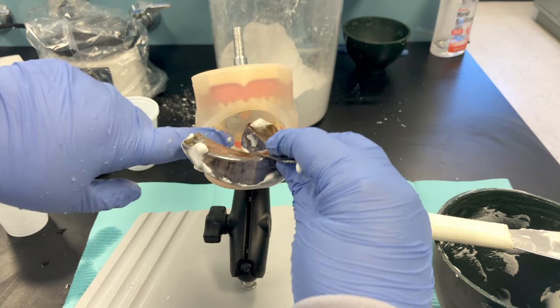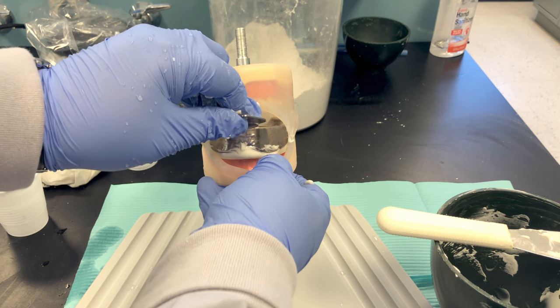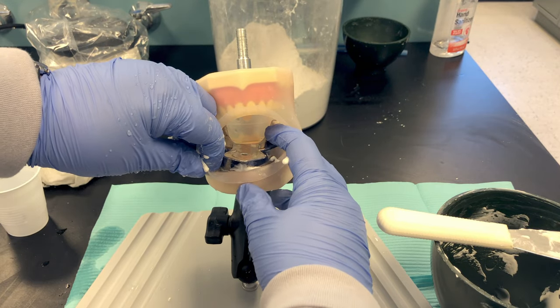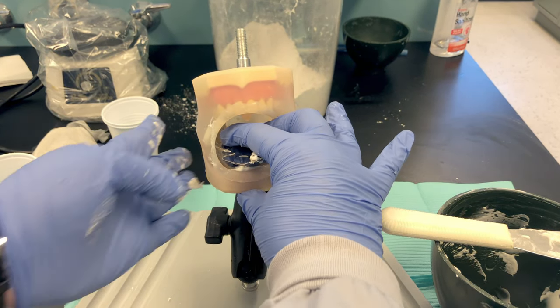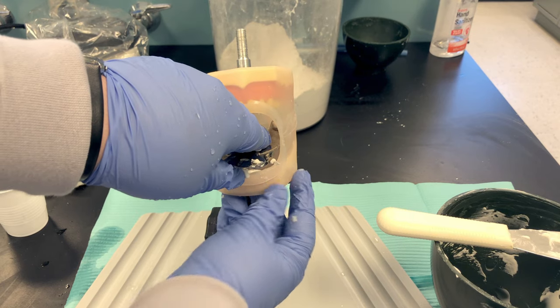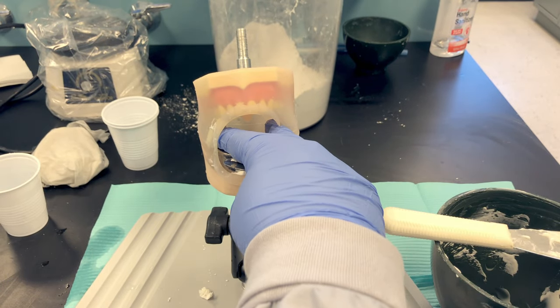Take a little extra material and wipe it on the occlusal surfaces. Insert at an angle and have the patient lift their tongue up and out so it doesn't get trapped. Seat the posterior first, then swing the anterior down into position — watch for alginate to squish out the front. Hold it in place, muscle trim by massaging their cheeks and lips to shape the material into the vestibule, and wait until it sets.